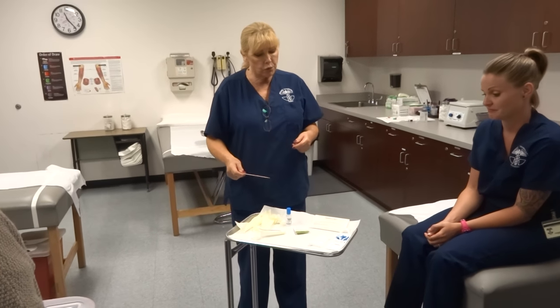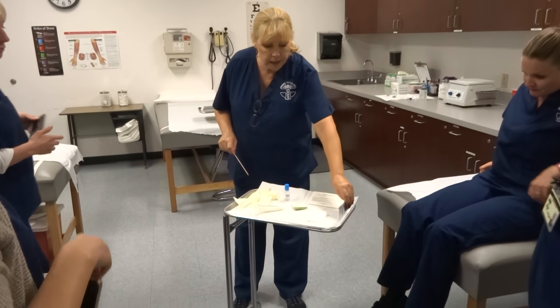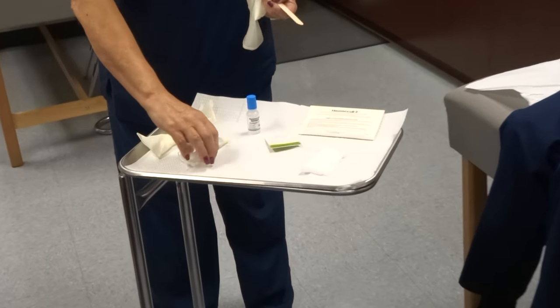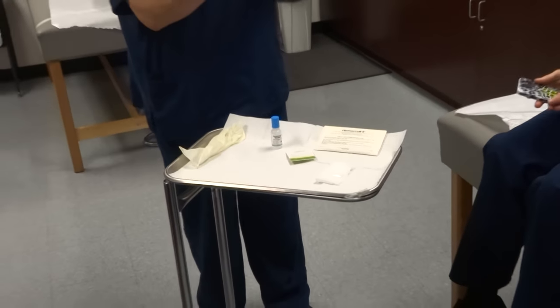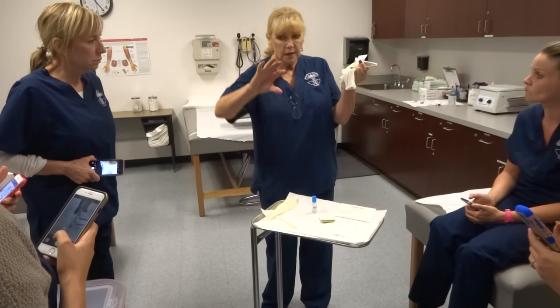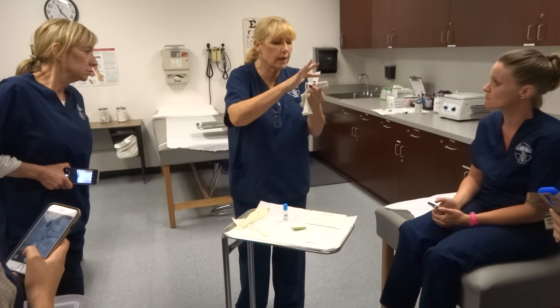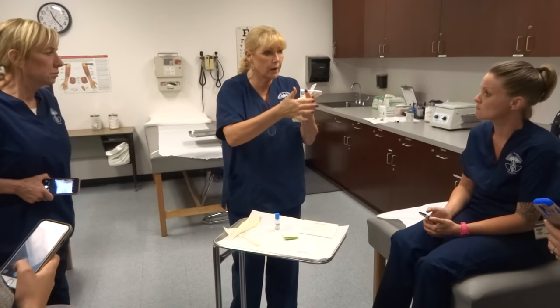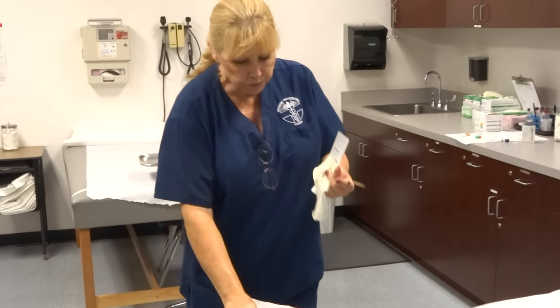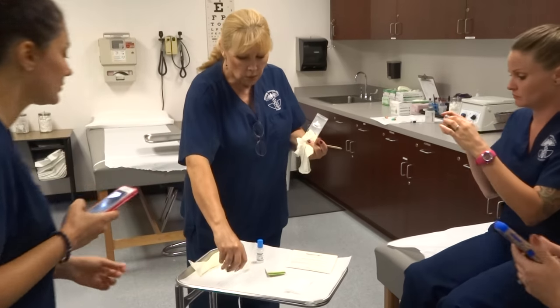You all have to show me how to do this — you might want to take a picture of this. I wouldn't put the lubricating gel on the tray; I'd probably just leave it like this. When he goes in and uses this proctoscope, it's lubricated on the tip. When it gets in there, he pulls this out. Then he usually has a gooseneck light that he can bring up there and look in to see all that rectal mucosa — he can look for hemorrhoids. This is just the lower section; we're not going up to the sigmoid. We're looking for fissures, fistulas, or hemorrhoids.